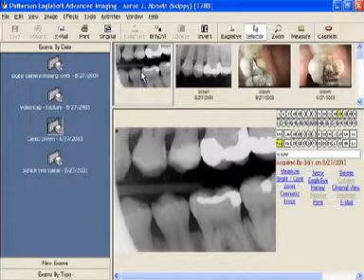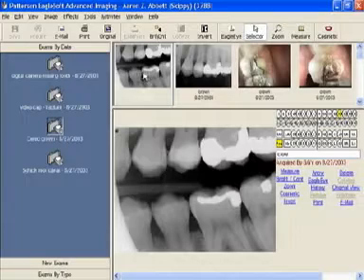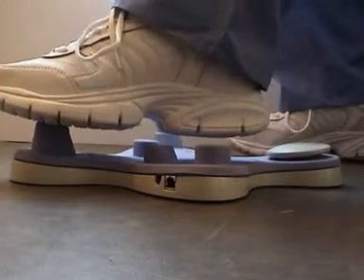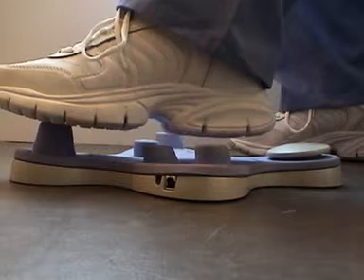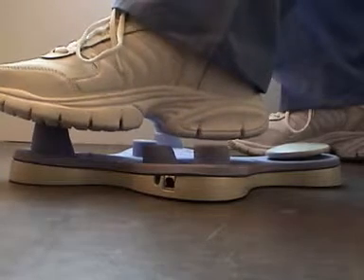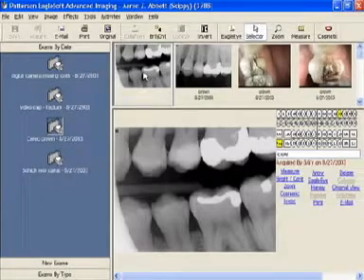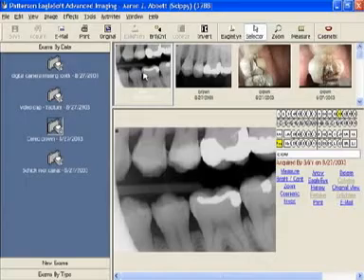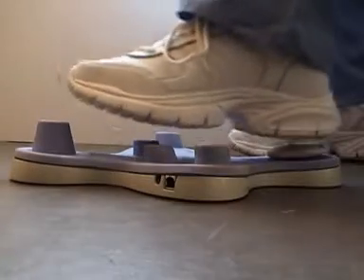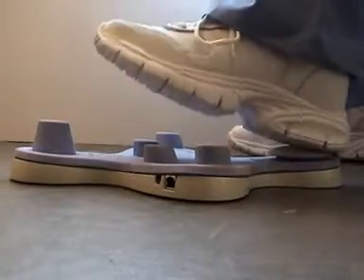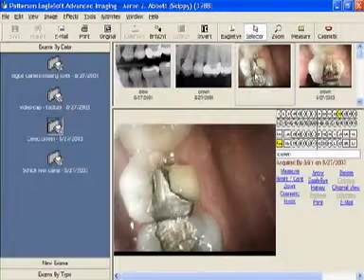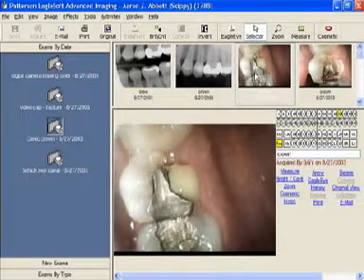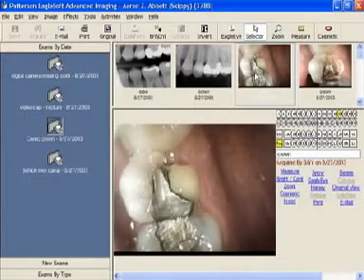If you want to capture with your intraoral camera, sometimes you have your camera in the mouth and you can't hit the button. You can put your mouse, park your mouse right on the word capture and then when you get your angle just right where you want it, all you have to do is heel click and it's going to capture your picture that you just took. Or you can just open up different pictures and talk and educate your patient while they're in the chair. They think that's really intriguing. They didn't take your gloves off and they think it's just magic.